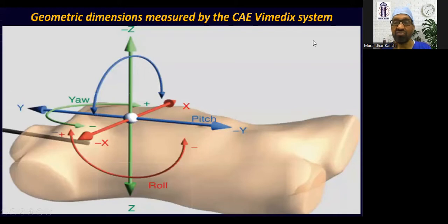For an echocardiography simulator to achieve its fullest capability, it would need to document the starting point precisely when a trainee is using it and track the changes in position in relation to X, Y, and Z positions, and the angular rotation of the scan plane, as well as the roll, pitch, and yaw of the TE probe, which would also need to be recorded over time.